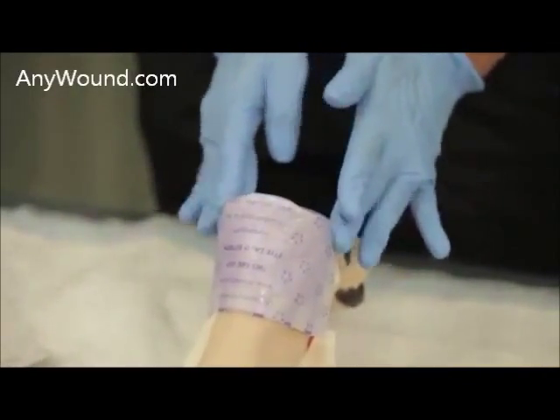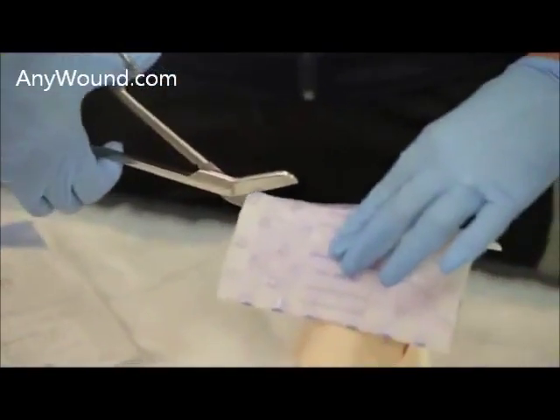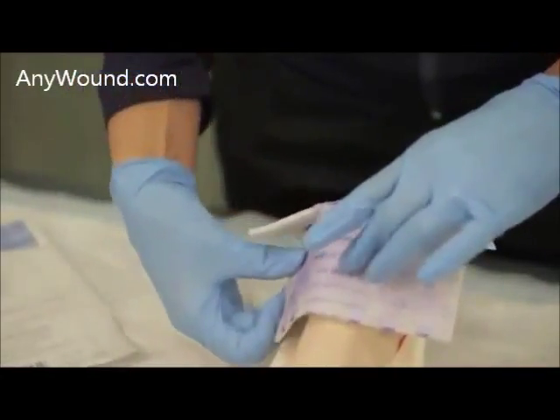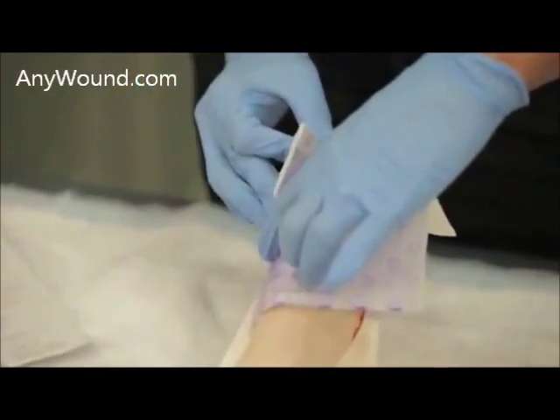That is one way you can do it. Another way is by cutting slits into the dressing and then adhering this side of the dressing down.